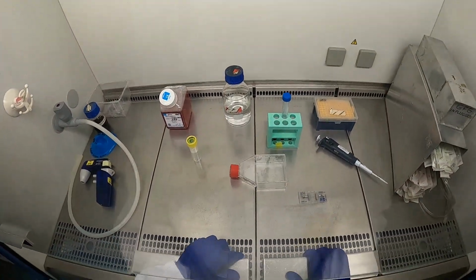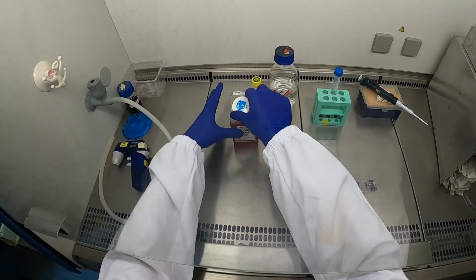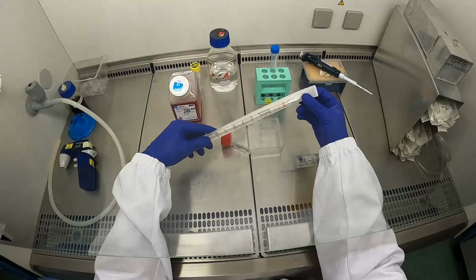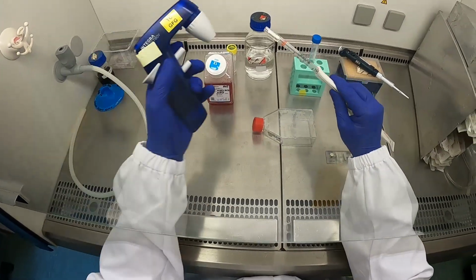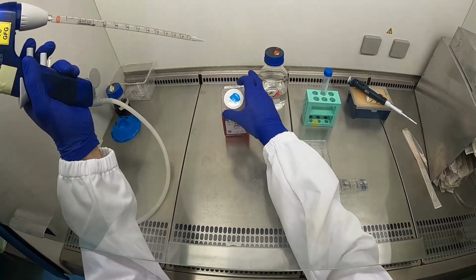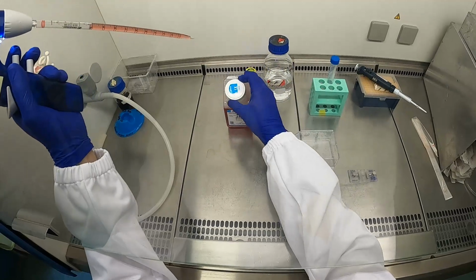And not only does the medium contain a lot of proteins because of the fetal calf serum, but it also contains specific trypsin inhibitors that are present in the serum. So adding that will stop the reaction and will prevent further damage to proteins on the cell surface and keep the cells happy back in the medium. So take 10 ml and add that to the flask.